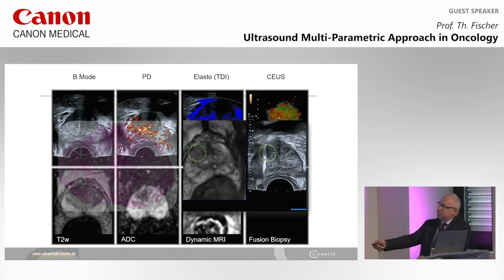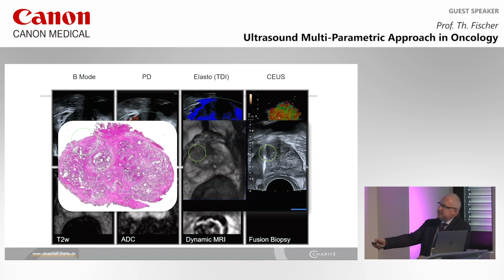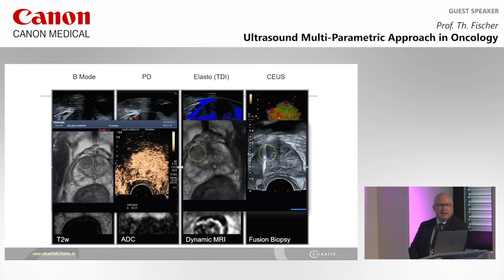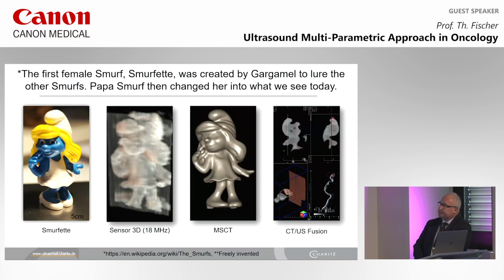This is our image fusion biopsy, and that's our result. That's the tumor. And that's the contrast inflow. That's the tumor, central zone, and now contrast in the peripheral zone. You see it takes 1 up to 2 seconds to have this signal enhancement, and if you don't have the right scan plane, we'll miss this tumor, and that's why we're focusing on image fusion. It's much easier to visualize the tumor and to do this.